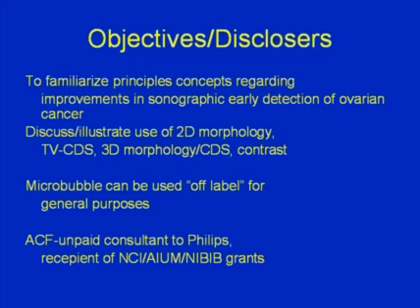Basically, this talk is going to cover concepts concerning improved sonographic detection of ovarian cancer using morphology, using color Doppler sonography, using 3D, and also the new development of using contrast ultrasound in finding differences between benign and malignant ovarian masses.